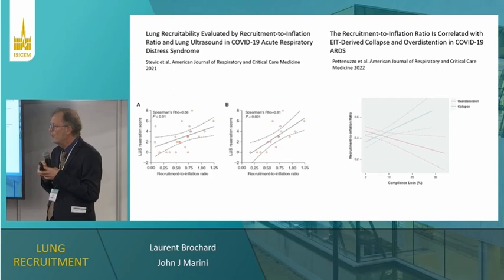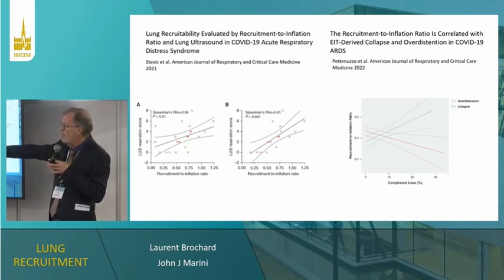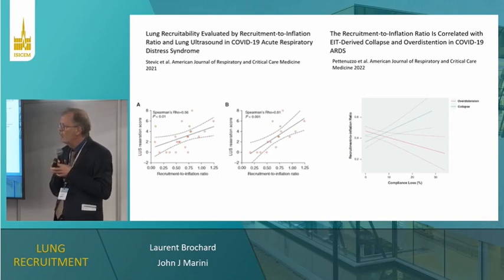So that's important. The second thing is that before doing the drop in PEEP, we recommend that for at least 2 breaths, you drop the respiratory rate down to 5 so you don't have any intrinsic PEEP, which may, again, make the calculation misleading. Yeah, that's an important point.